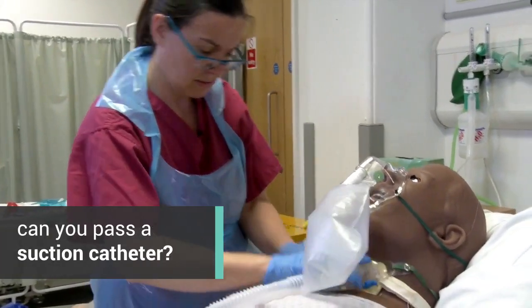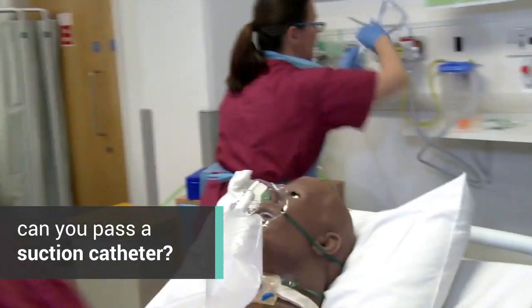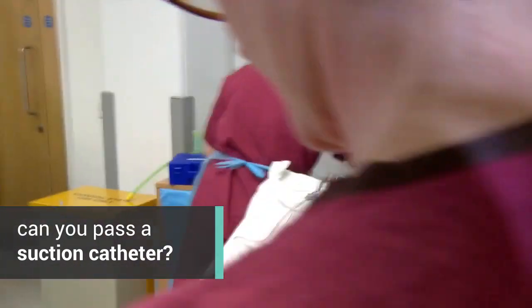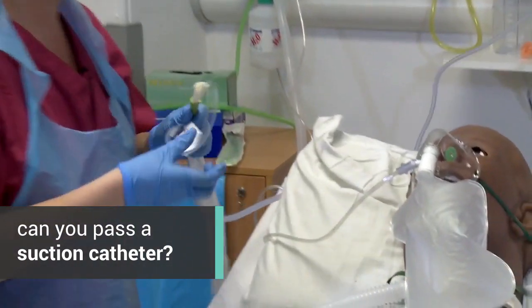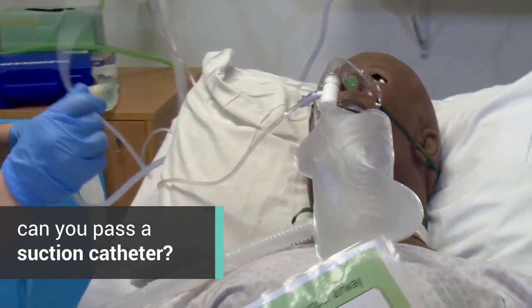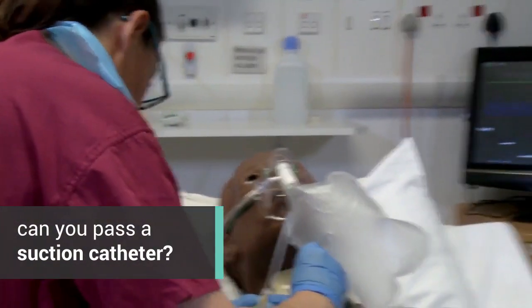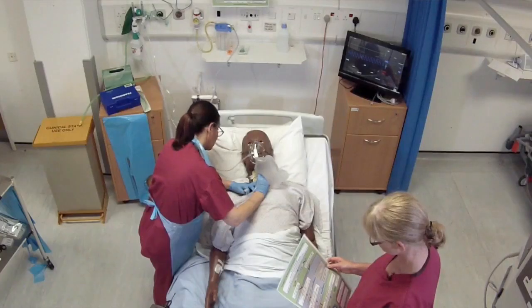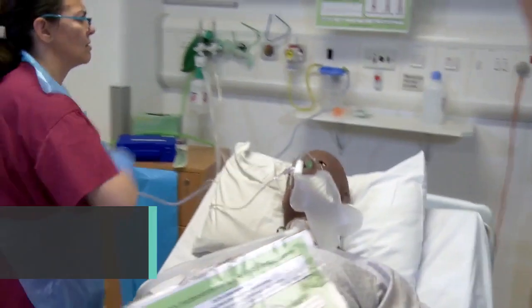So the next thing is to see if we can pass the suction catheter. Suction's on. Let's just see if we can make you cough there, Robert. I'm not going beyond the depth of the tube at all there. So the next stage is we need to deflate that cuff.